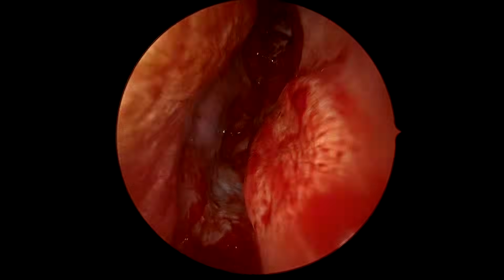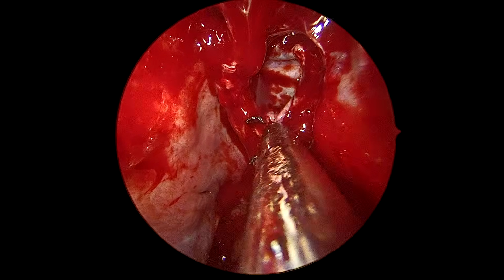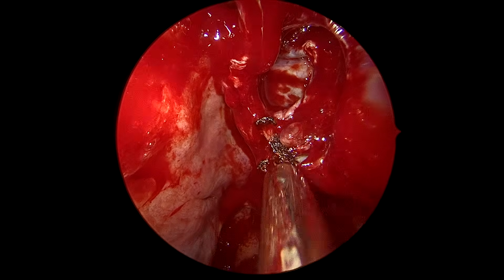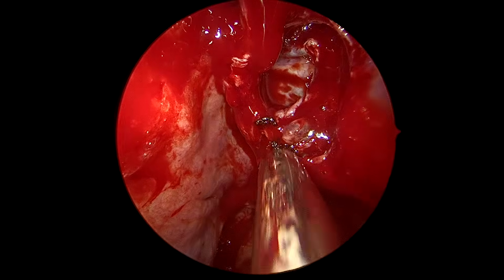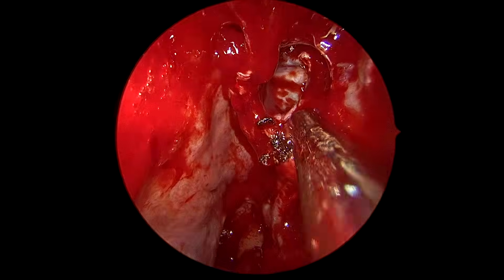So I told you I did one step extra for this patient just to have a clearance. This part is completely clear. Some amount of ooze is there that will stop on its own.